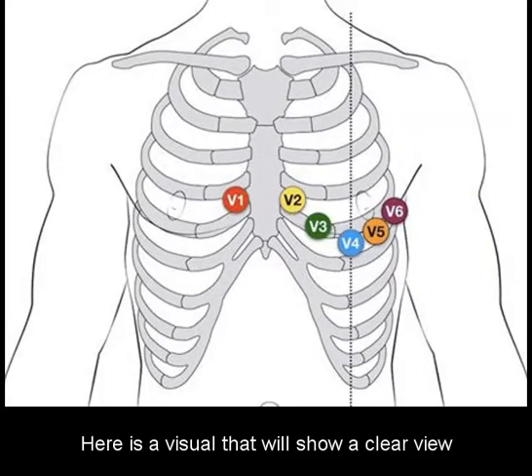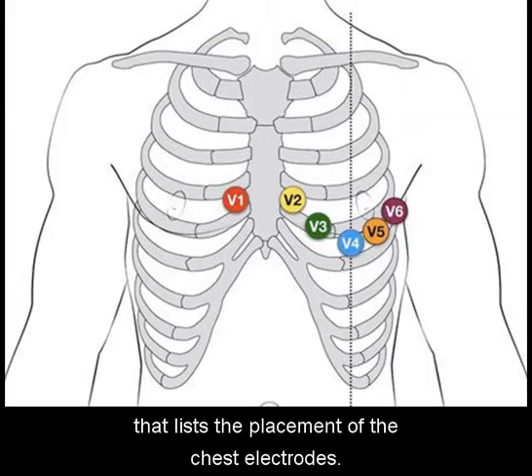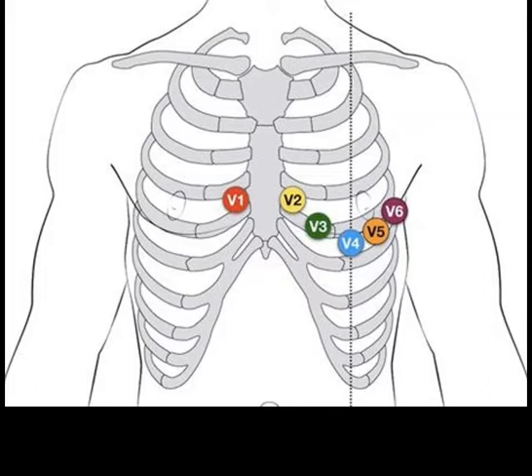Here is a visual that will show a clear view that lists the placement of the chest electrodes. You will want to place them in the following order: V1, V2, V4, V3, V6, and lastly, V5.